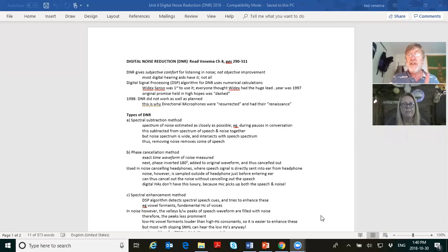You had Michelangelo, the sculptor, and Leonardo da Vinci, and all these artists. So D mics really did go that way. They were there, then they died out for a while, and then came back. And the significance of their rebirth was because of the fact that DNR did not improve speech recognition the way Widex thought it would.